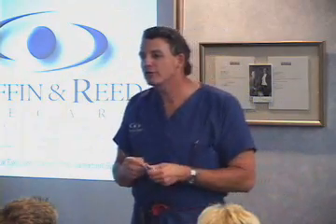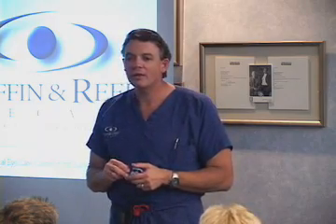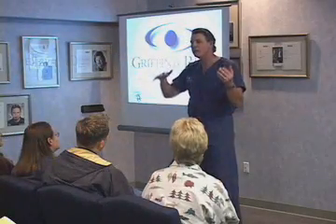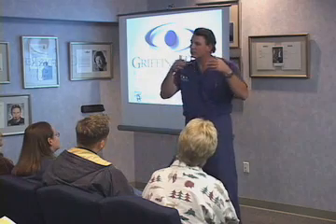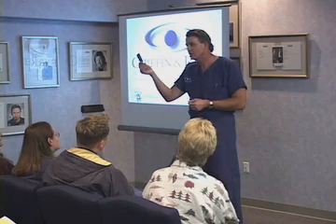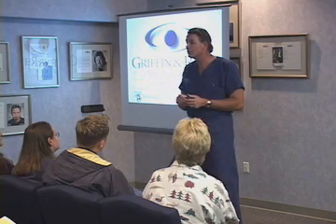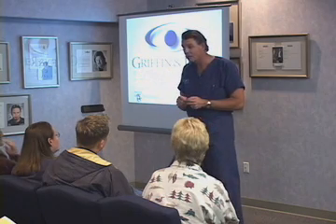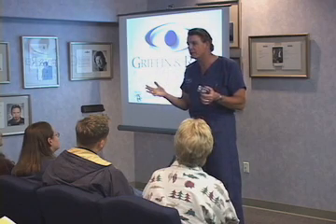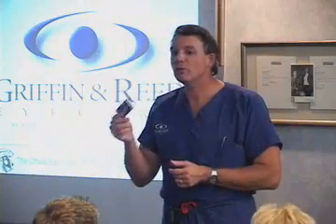If you do custom ablation, it's not the same card, okay? When they came out with the custom system, they changed the fees and they didn't put the custom software that'll do the unique imperfections on the same cards we can program to do near and far-sighted astigmatism. And they jacked the cost up on the cards. So it's a different card. So you have to upgrade to a higher grade card, and the upgrade costs about $450 per eye. And that's why, unless you need custom ablation from some standpoint other than, you know, we want to make VisX rich, then we go over it with each person and tell them.